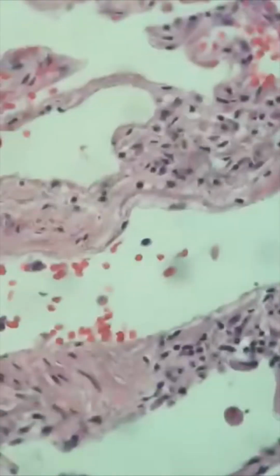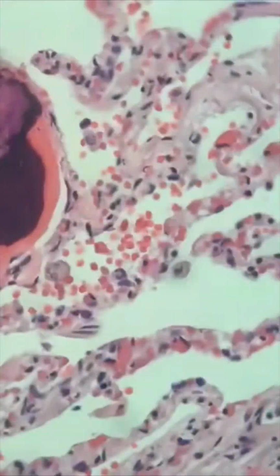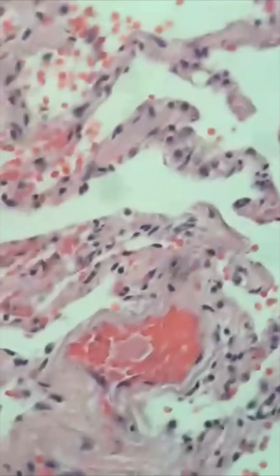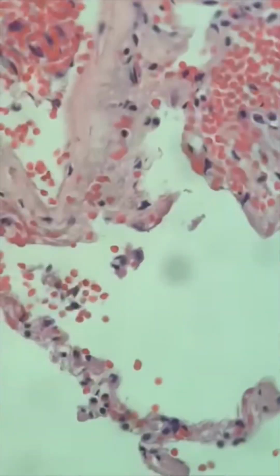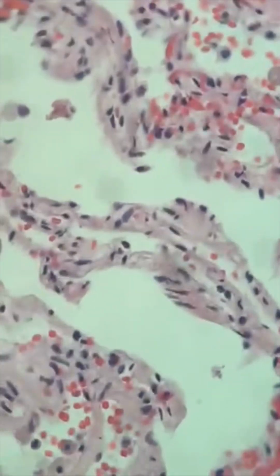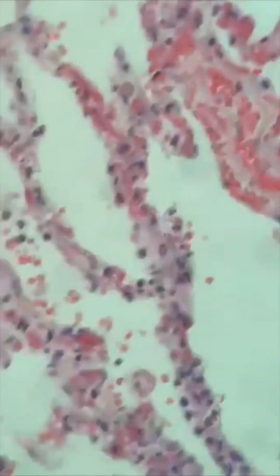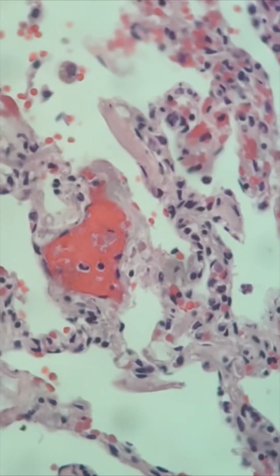There is no fibrosis, and there is no histological evidence of active COVID-19 disease. This is just calcified plaque, actually calcified debris. I'm not sure if that's plaque, but be that as it may, normally you can see changes with COVID that have already been defined, and I've talked about many cases of COVID. This is not a COVID-19 lung. Okay, so we're going to go into the next histology, which will be the heart.